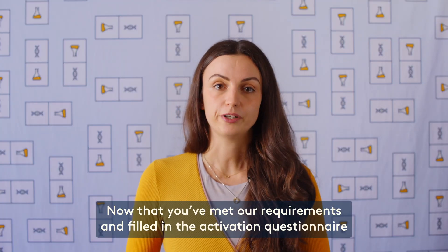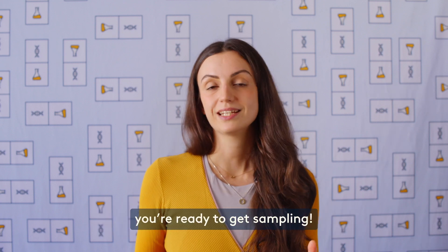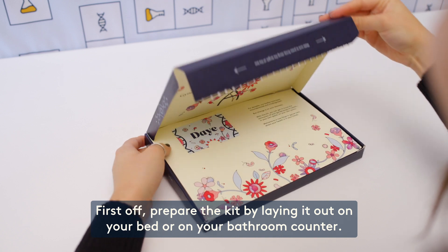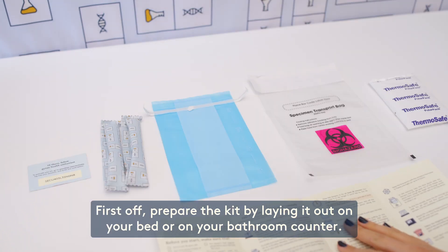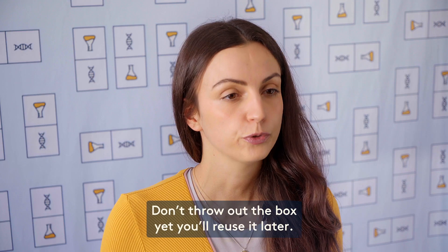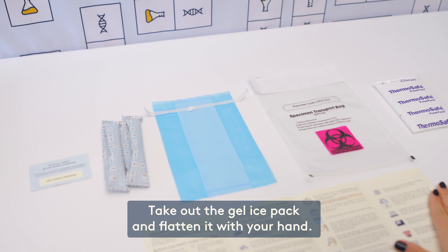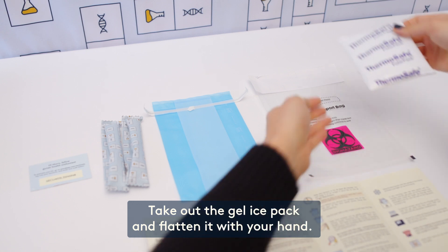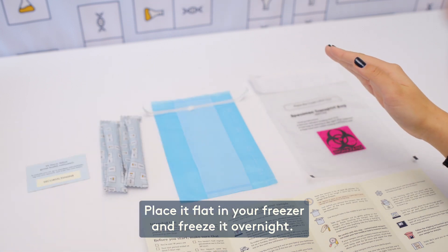Now that you've met our requirements and filled in the activation questionnaire, you're ready to get sampling. First off, prepare the kit by laying it out on your bed or on your bathroom counter. Don't throw out the box yet — you'll reuse it later. Take out the gel ice pack and flatten it with your hand, then place it flat in your freezer and freeze it overnight.